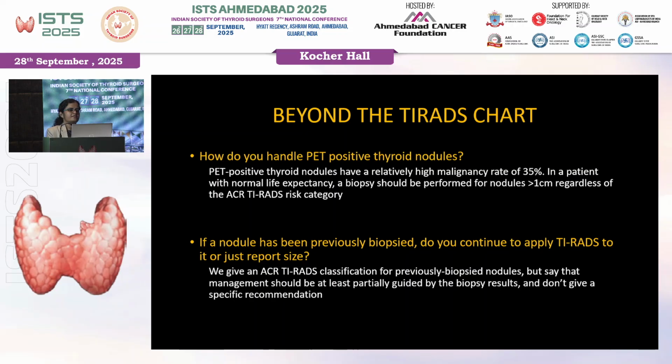In that case, TIRADS has the present limitation that we don't know how to handle those nodules. But you do a formal TIRADS reporting and then say that your management should be guided by the previous FNA report and the clinical symptoms rather than purely on the basis of TIRADS.